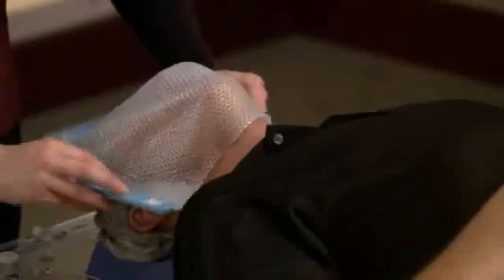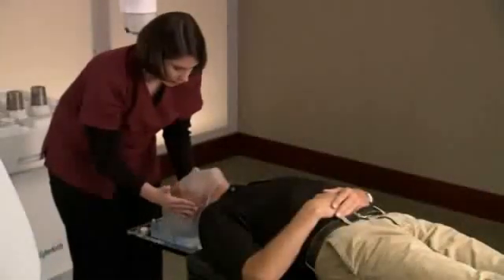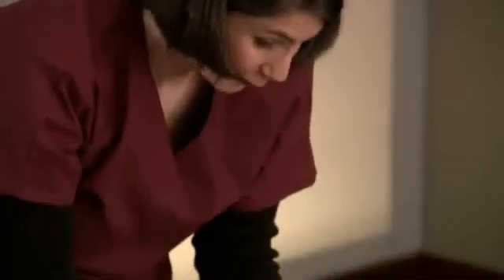During setup, a flexible mesh mask will be created and custom fitted to your face. Your radiation therapist typically performs this step. This comfortable and non-invasive mask will be used to stabilize your head and neck during treatment.